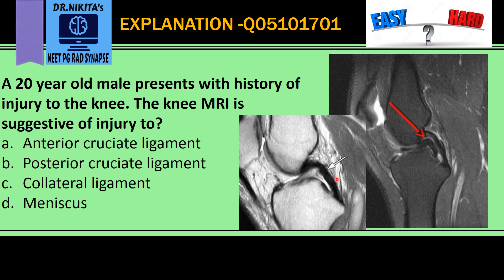That is how a normal PCL, or posterior cruciate ligament, looks — it is like a dark band present posteriorly, connecting the femur and the tibia.